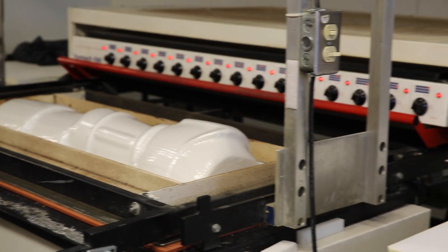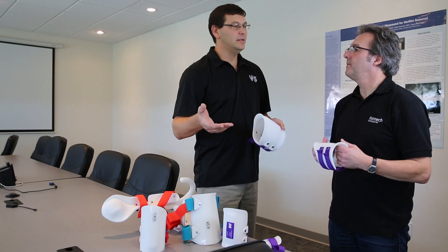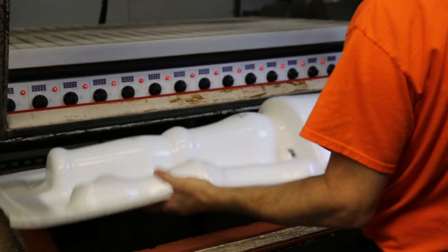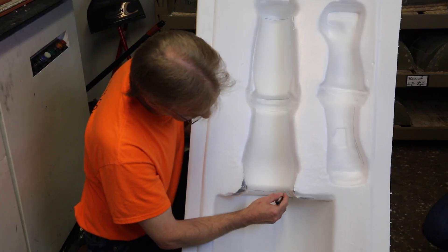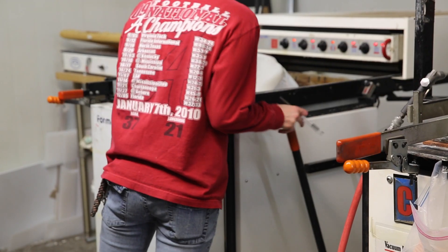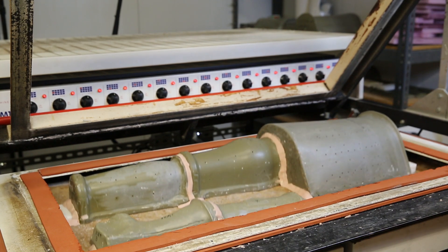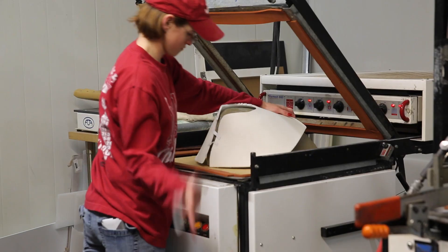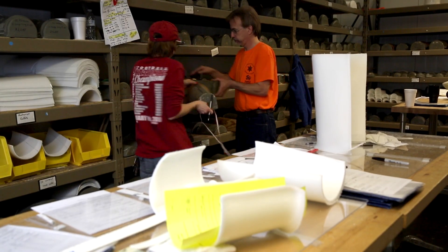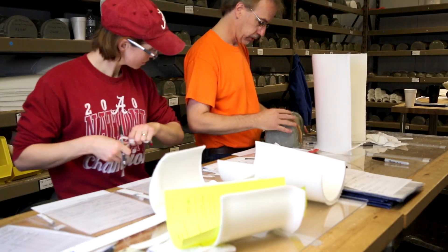We chose Formec because of the compact size — they're easily accessible so you can get to the mold and the tooling on them easily, and they're also very versatile for what we do here at Joint Active Systems. We use all manual machines and semi-automatic machines due to the reason that we change out our molds constantly throughout the day. Being able to easily change the tooling and molds is very important to us.